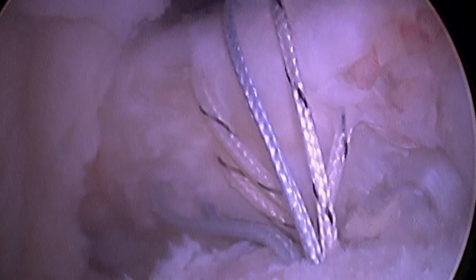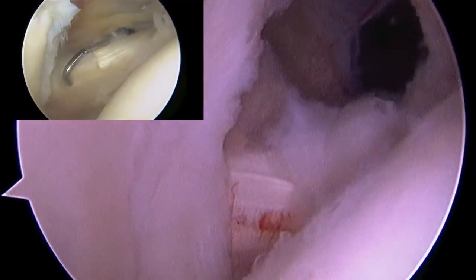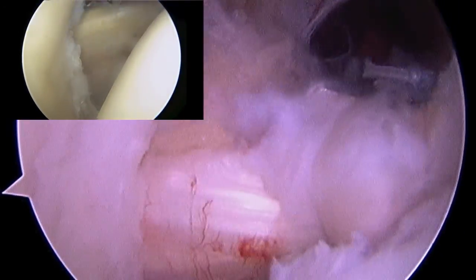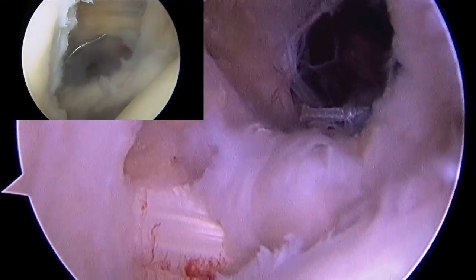You can also see I've prepared the bone to bleeding so that it will promote healing. With the stitches tied down, I've now restored the integrity of that subscapularis tendon so that when I move the ball of the humerus, the subscapularis tendon moves as well. Comparing that in the inset video to a normal subscapularis tendon, you can see we've effectively restored the function.